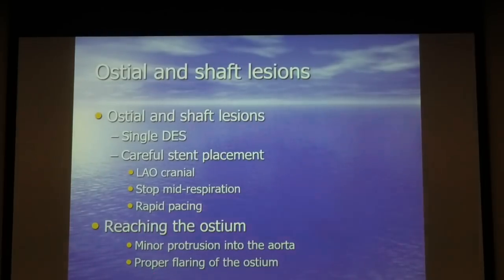When you have a true ostium, we always go with a proper flaring. Your balloon, you pull it back a few millimeters and you go very high pressure. If you still think that you need a better flare, you use a larger balloon at lower pressure because the stent that's in the aorta will dilate immediately. It has no resistance. If you use a larger balloon, the initial response will be the flare of the segment that is in the aorta, and that will give you proper flare, easier access in the future, and less restenosis.